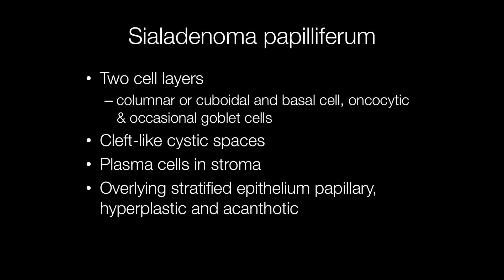Histologically, sialadenoma papilliferum has two cell layers: a columnar or cuboidal layer and an outer basal cell layer. In addition, oncocytic and occasional goblet cells may be present. The tumour forms cleft-like cystic spaces and the stroma typically has a dense plasma cell infiltrate.